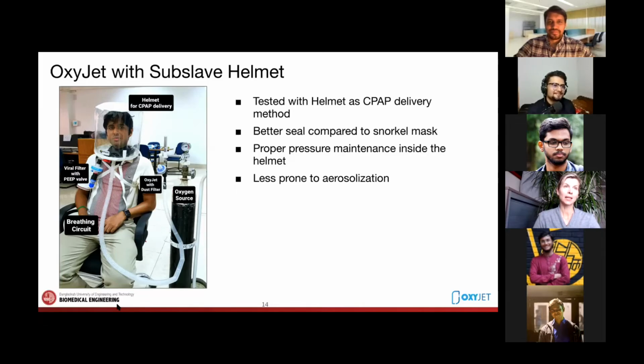So it can all be done with a 3D printer, right? Yeah, but there's a metal part that we need to make using some other workshop equipment. Otherwise it's quite simple. Okay.